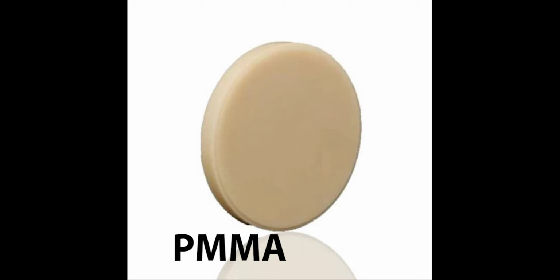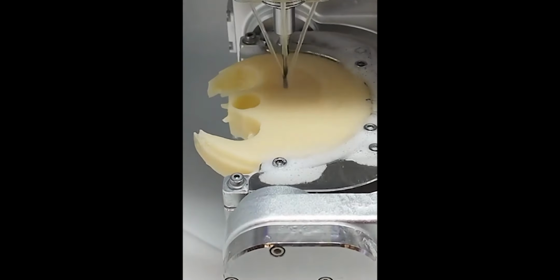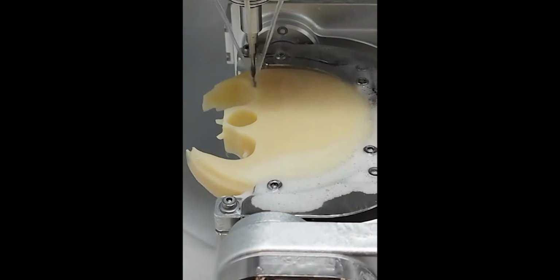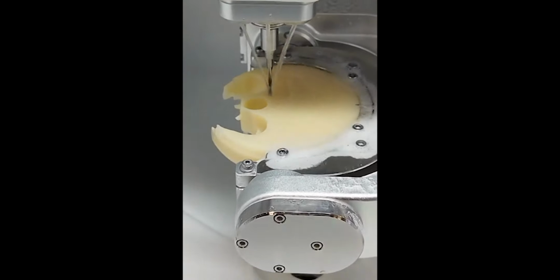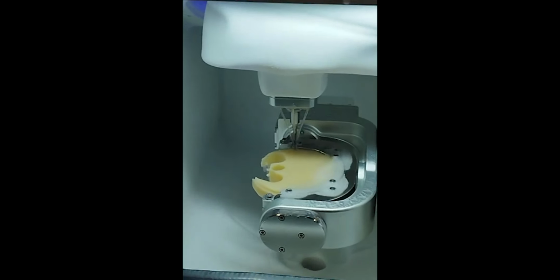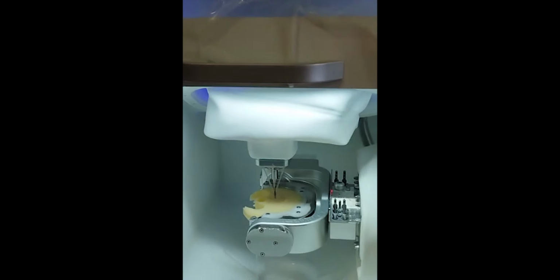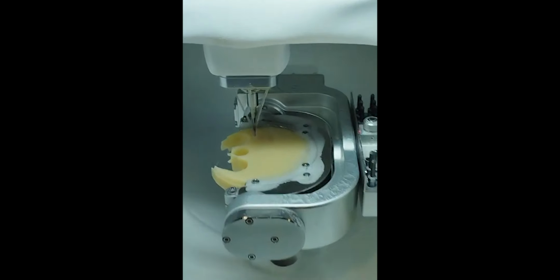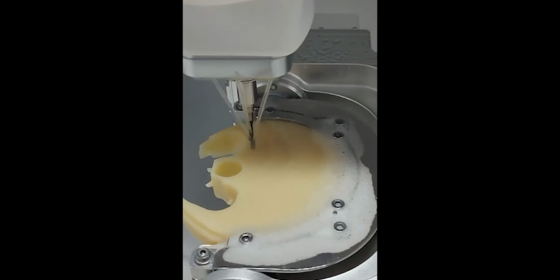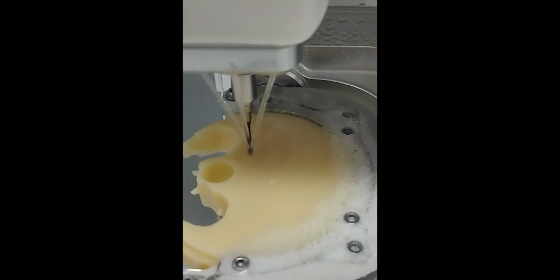What about the bigger ones, bigger crown and bridge cases? So this is the blank from which we're going to make our prototype. So the blank gets put into the milling machine, and here the blank is getting milled into the shape that we want it to be. It takes quite a bit of time. It's supposed to be very, very accurate. So the dentist then tries the prototype into the mouth, checks it for aesthetics, function, occlusion.